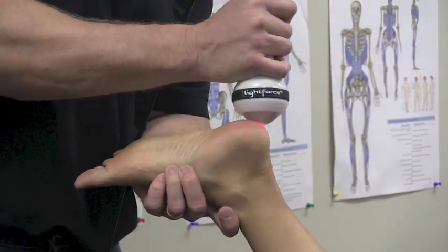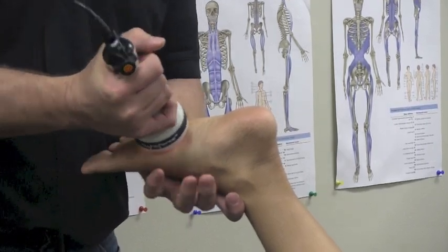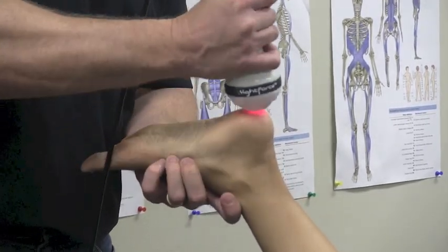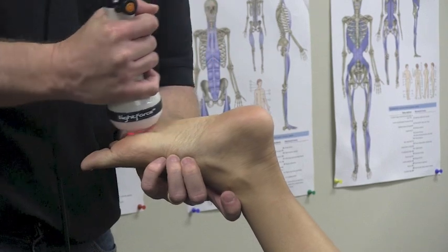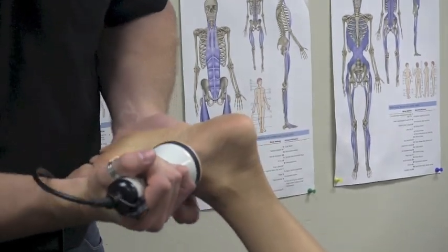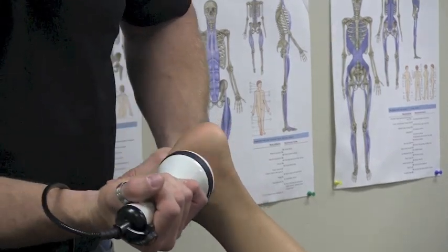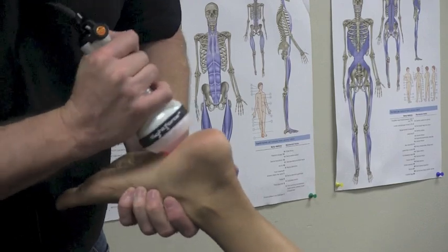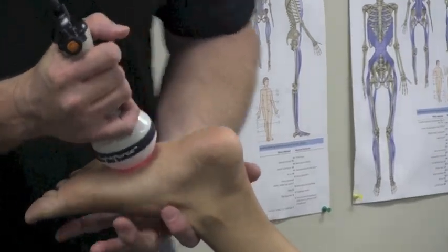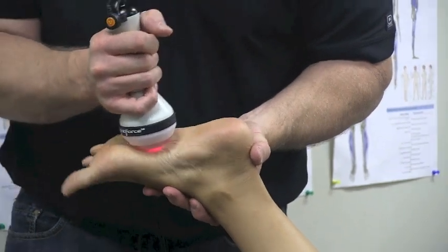We'll deliver the laser therapy first to the bottom of the foot, right around to the heel and the fascia, concentrating on the medial part which is usually the most tender. Notice what I'm doing here — I'm actually moving the foot around, controlling what it does, and I'll have the patient flex and extend the toes so the toes will come back and they'll go down.